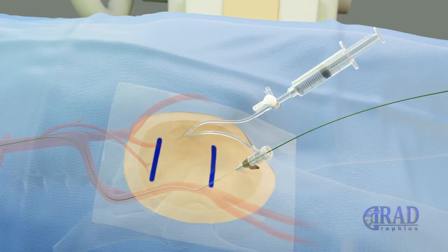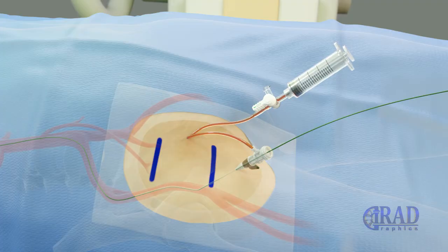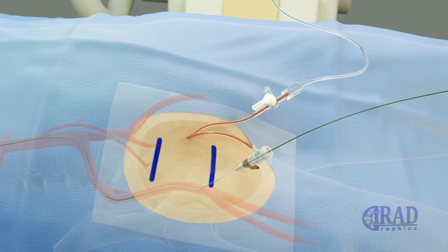At this point, the sheath is aspirated and flushed with heparinized normal saline. Contrast may be injected to assess the patency of the common femoral artery and safety of the access. Subsequently, infusion of normal saline is started through the sheath to avoid possible clot formation at the tip of the sheath.